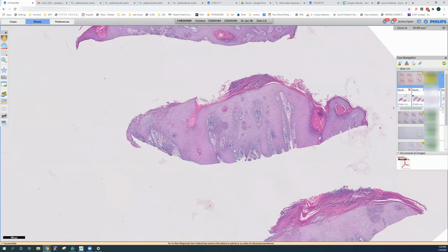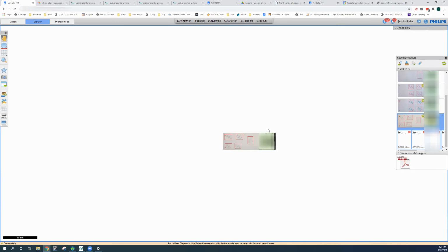So this is actually the prototypical histology of condyloma lata. It is not entirely specific, but when you see this marked epidermal hyperplasia and marked neutrophilic infiltrate, you think about it. Let's go to the spirochete stain.